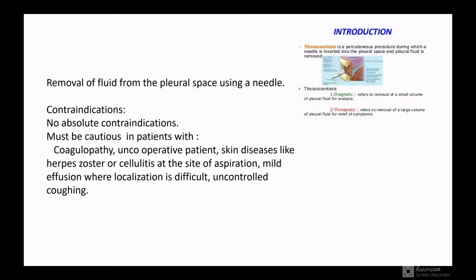Now it has some contraindications, and you have to be cautious with patients who have coagulopathy, uncooperative patients, skin diseases like herpes zoster or cellulitis at the site of aspiration, a mild or localized effusion, and uncontrolled coughing.